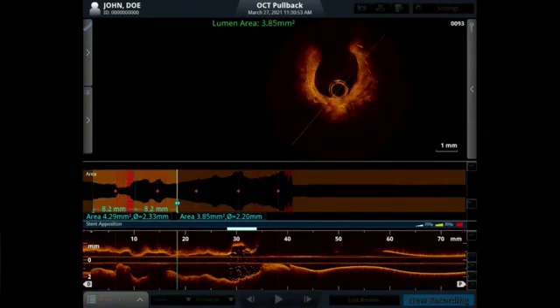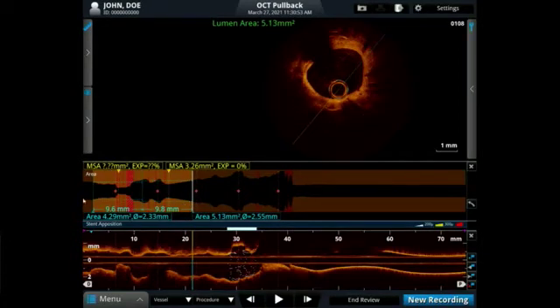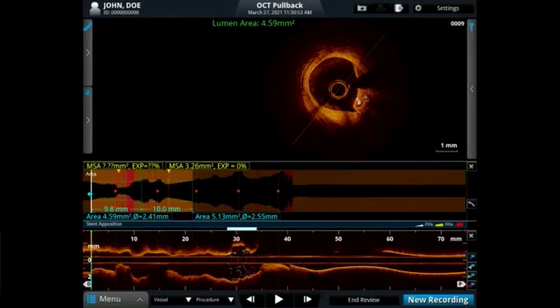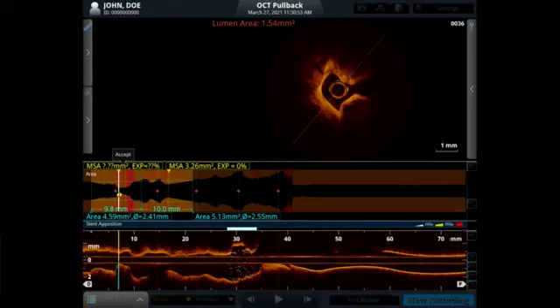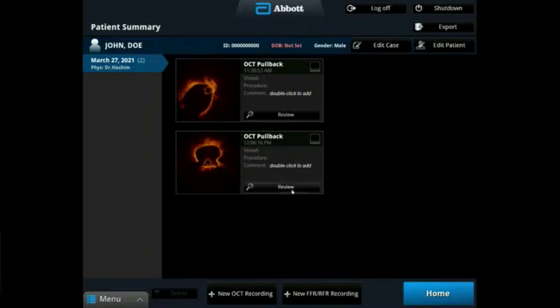Yes. So probably here I was thinking of at least a 20 length stent. The longest you can, though. Yeah, the longest I can. I agree. Make sure you don't miss it. Yeah, just accept that. So you've gone from 1.6 millimeters squared. I think the MLA I saw was about 3.79, 3.8. So yeah, I'm gonna get you here.